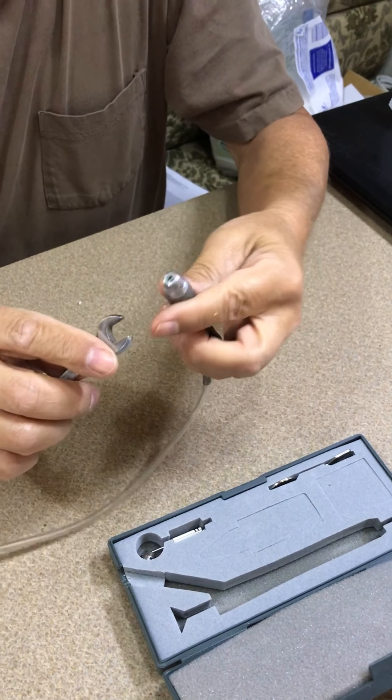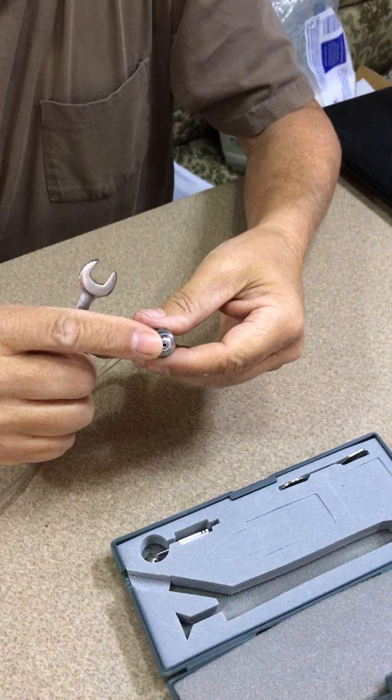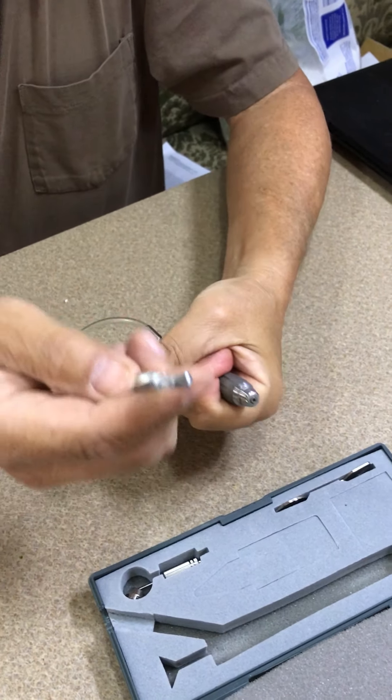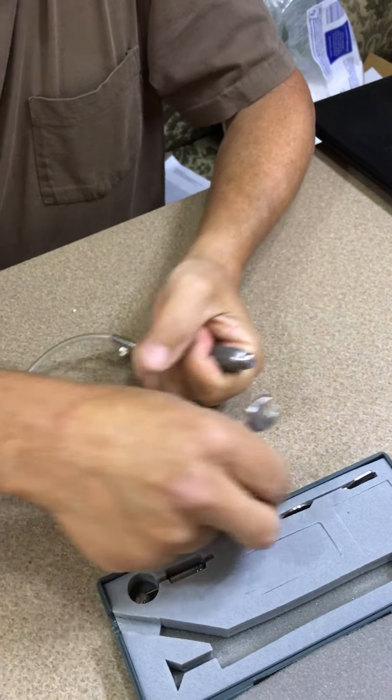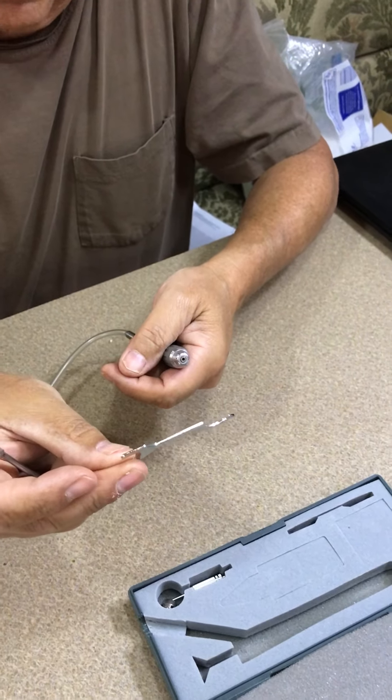We're going to show you how to change the turbine cartridge. Firmly hold on to the tool — this is a 3/8 inch wrench. Do not use the little thing that comes in there; you need a real wrench to do this.